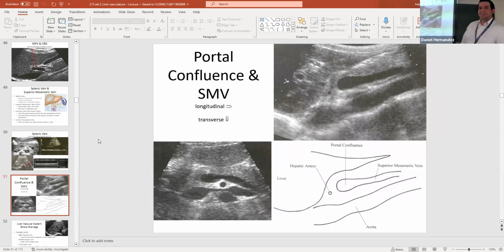Yeah. That looks like aorta. It's definitely aorta. It's just perfectly uniform, it's not wiggly or squiggly. It's perfectly straight. That's definitely aorta.